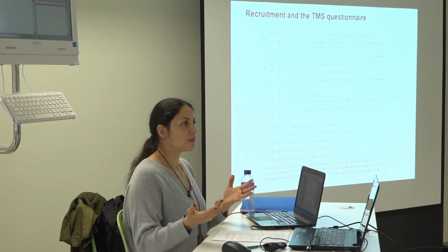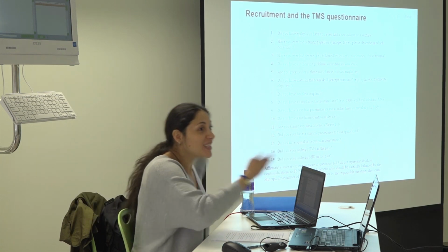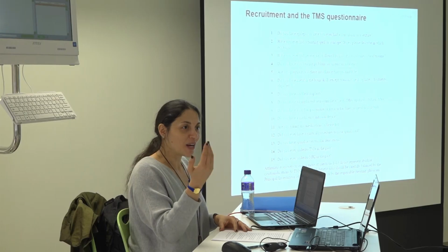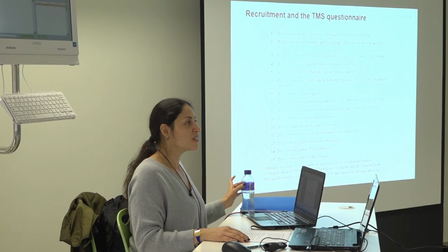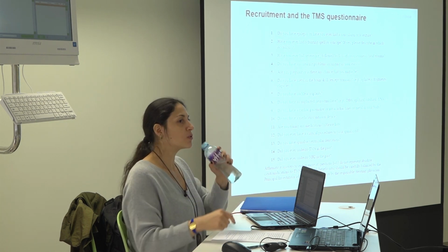I said no, I cannot measure, because the person is overreactive. I hadn't even put the coil on; it was in the back, I don't know how many centimeters from the person's head. Would you measure this person? No, because you don't know psychologically what effect it will have. So don't measure. You should also write that in your consent form.